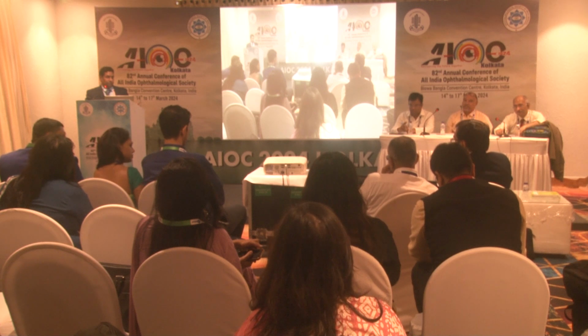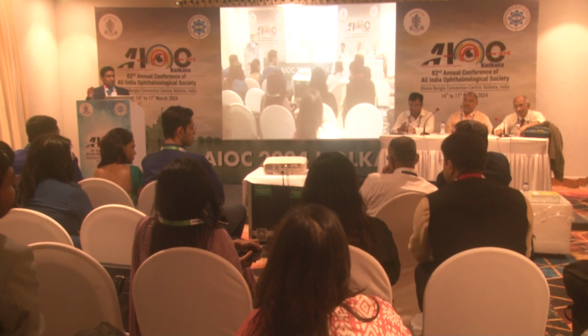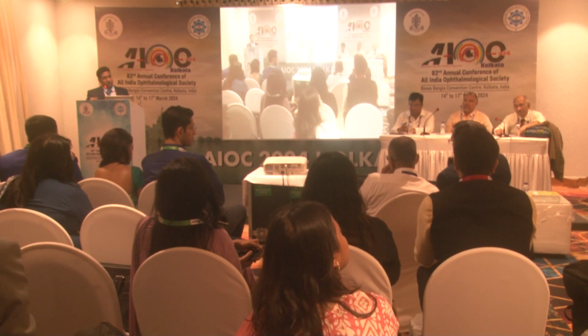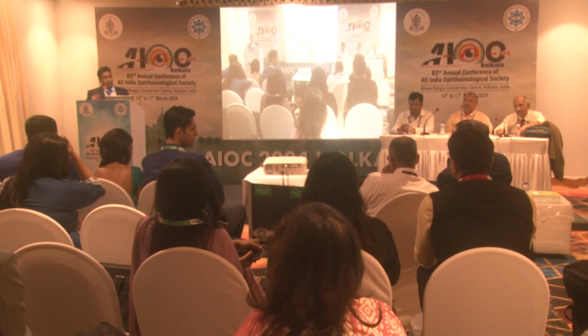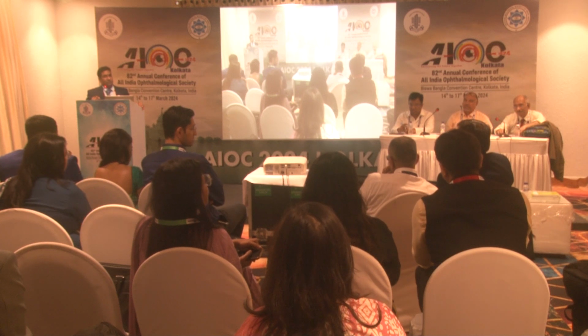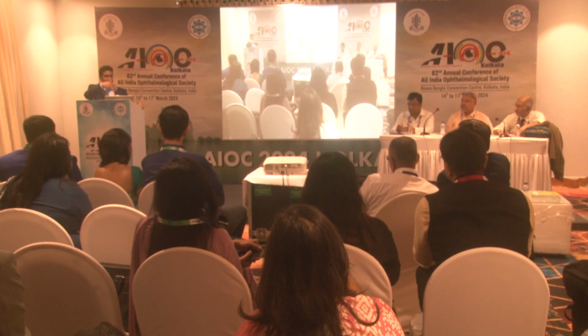The sclera at the infratemporal quadrant is maximum about 0.9 or 1 millimeter, so you are partly in and partly out. As I have shown, initially I go in a sloping manner, then make it vertical to reach. But that definitely is a little blind.